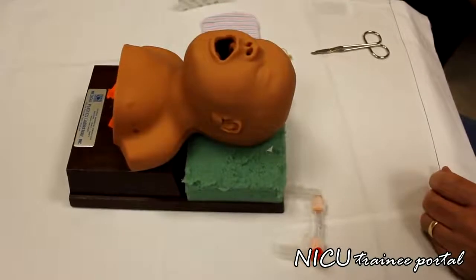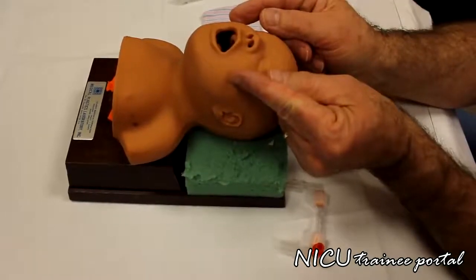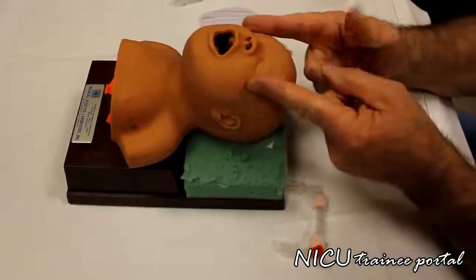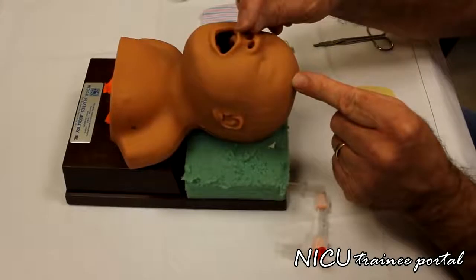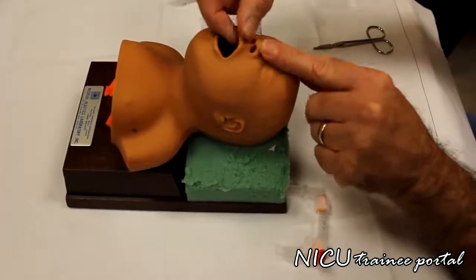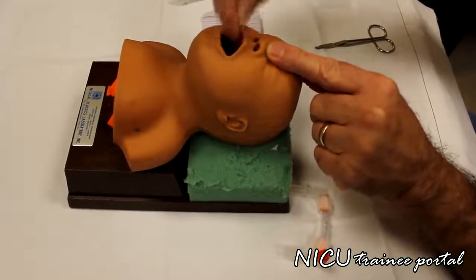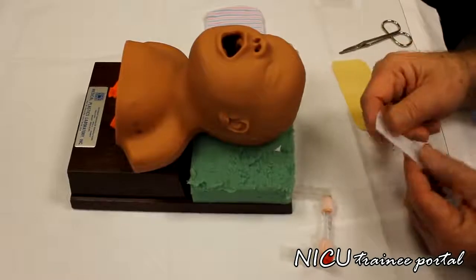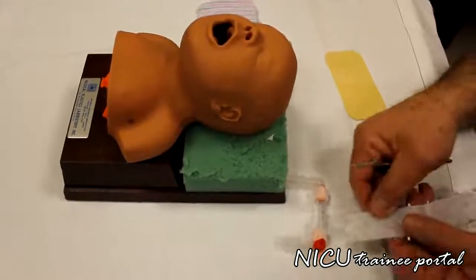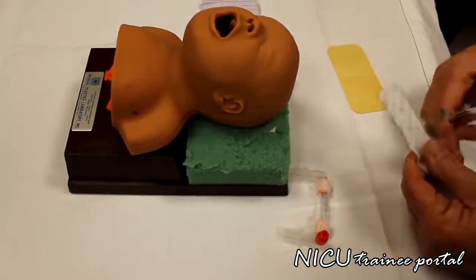And the next thing is we want to make the mustache. Typically I like the mustache about mid-cheek, or probably lines up with the outside of each eye. And you want to be probably about 2/3 of this width between the edge of the nose here and the upper lip. So I usually start with the looped side. It's the opposite of that one. It's on the barrel of the prongs.